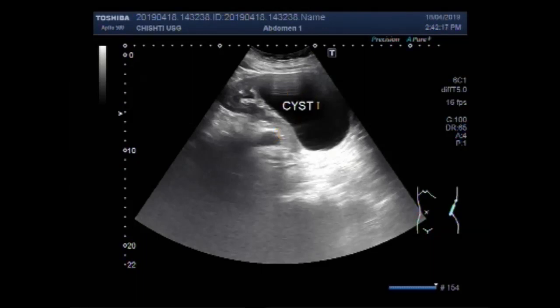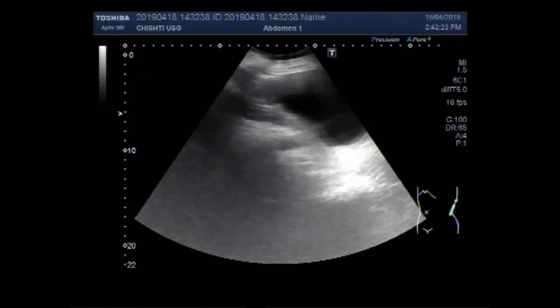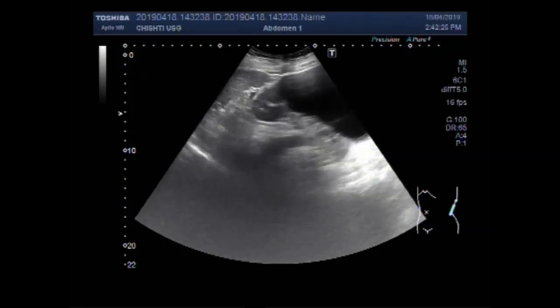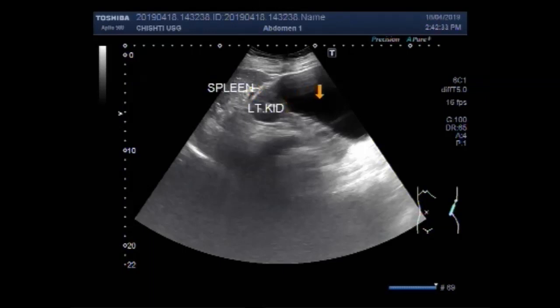This is the cyst and this is the left kidney. This is a simple cortical cyst. Now this plane is also visible — this one is the left kidney and this is the cyst.